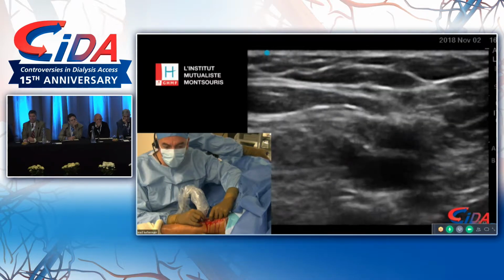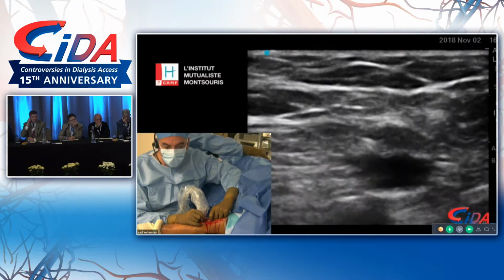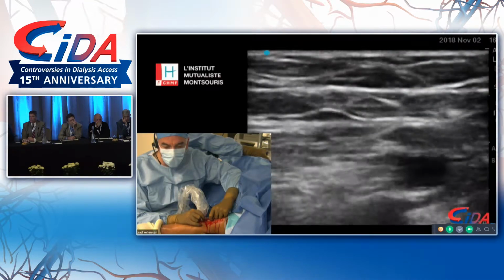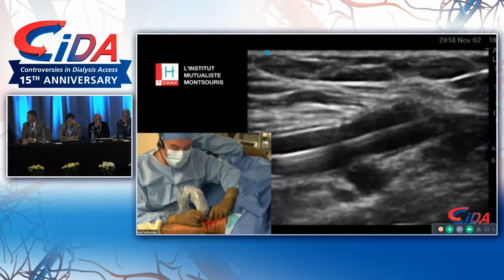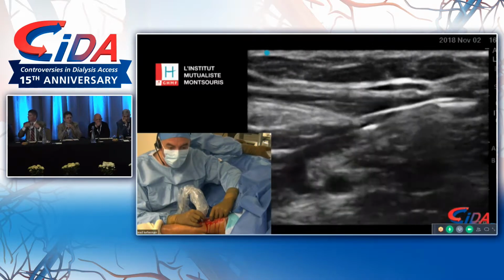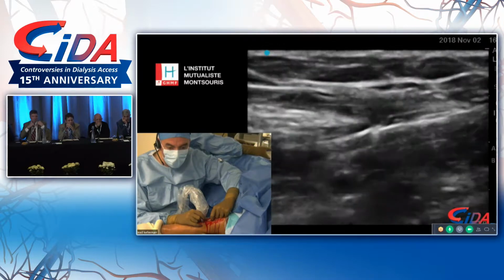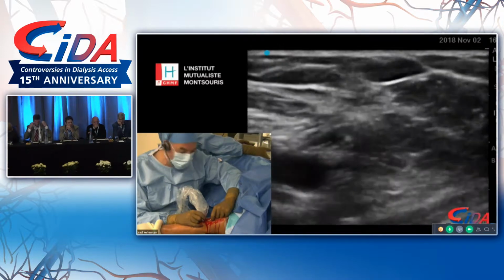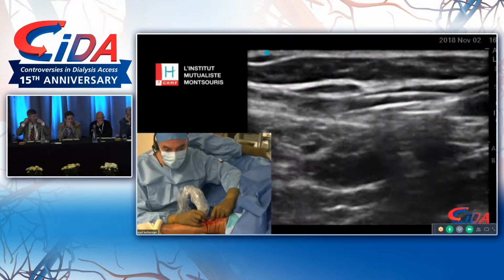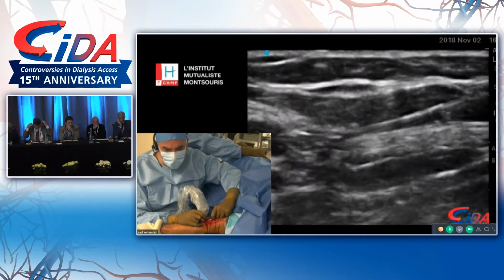You see the artery coming in here. You see the artery that is meeting the balloon. So I know that I'm inflating well the anastomosis and the perforator. So I'm going to pull the balloon back with the sheath all together, and I'm going to inflate the perforator a bit higher, go. And now I'm inflating the whole length of the perforator.